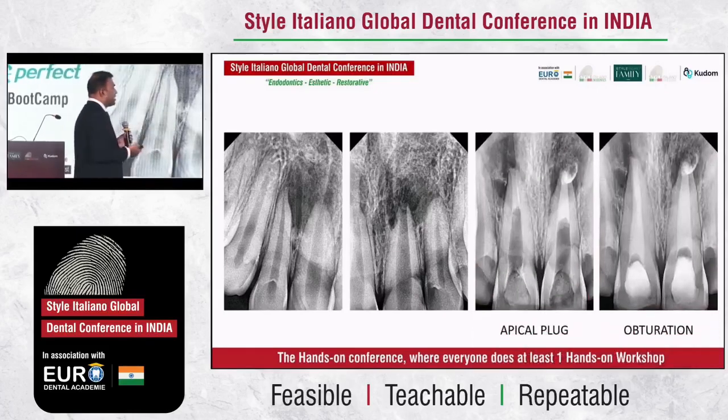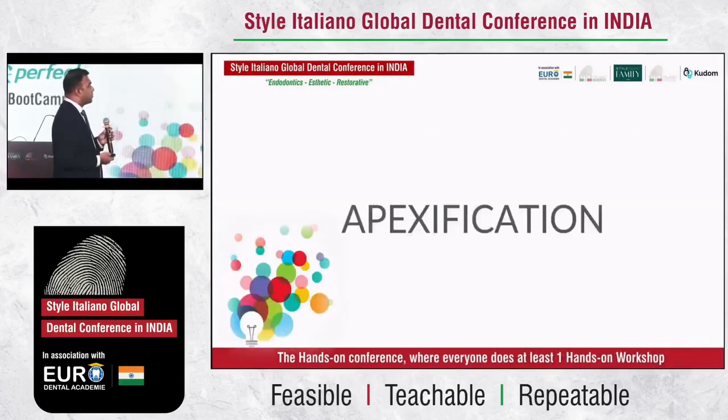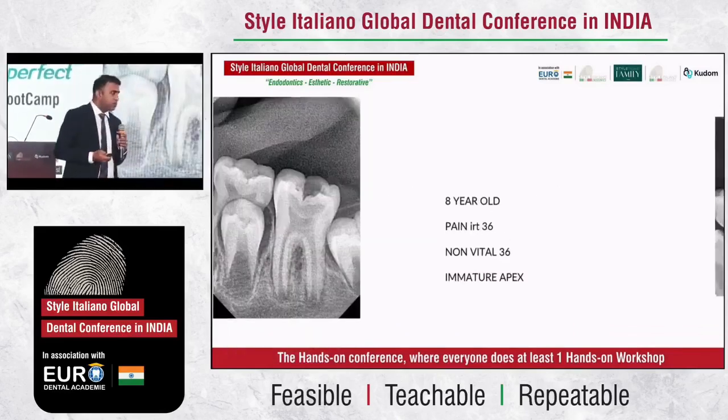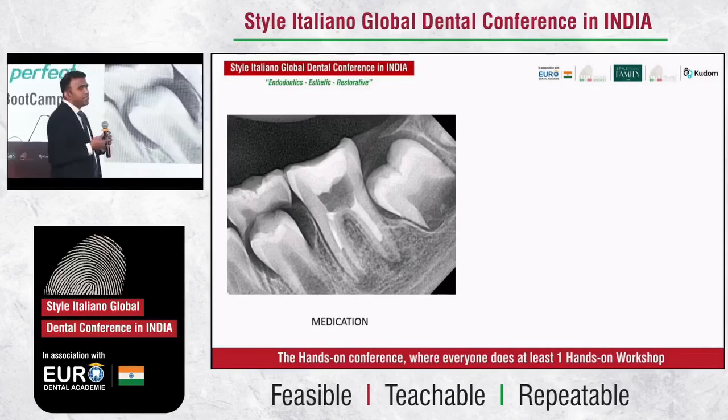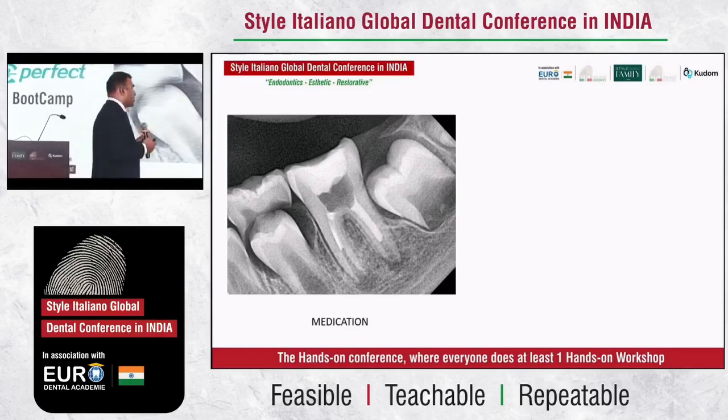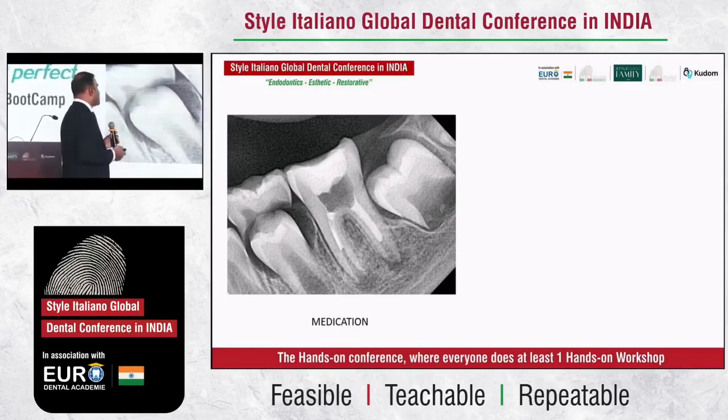This is another case, again same technique, apical plug first, then complete the obturation with tricalcium silicate. From apexification, we move on to revitalization. Again, it is same as apexification, but the strategic placement of tricalcium silicate will differ according to the case. No instrumentation technique is used.